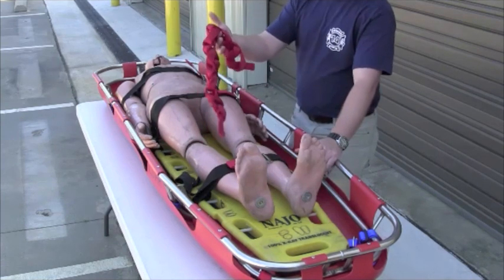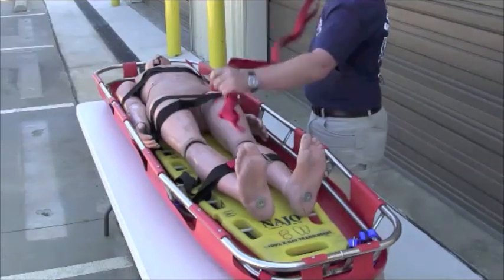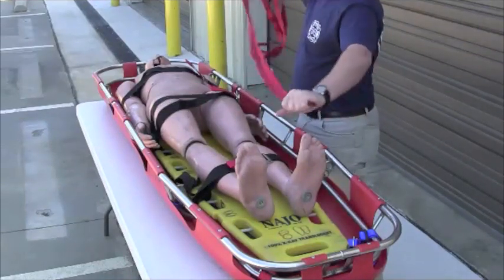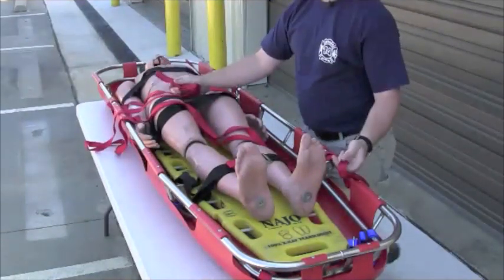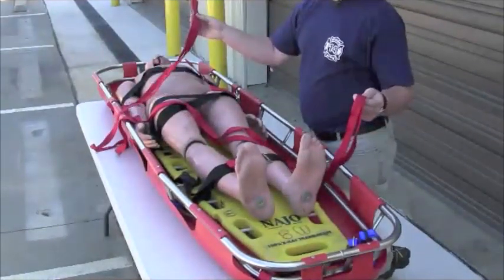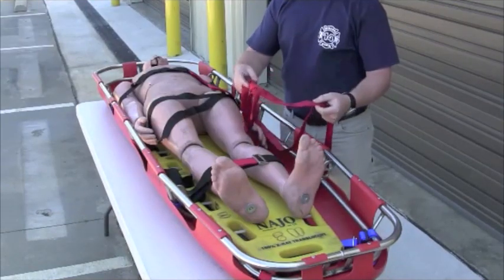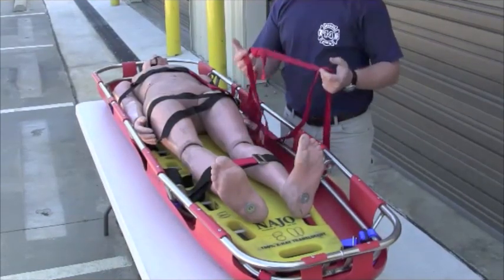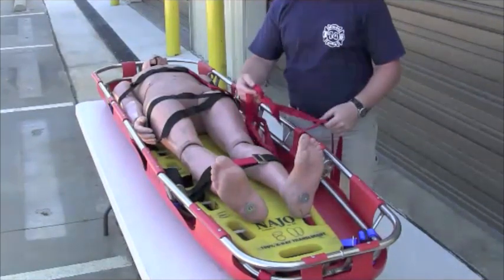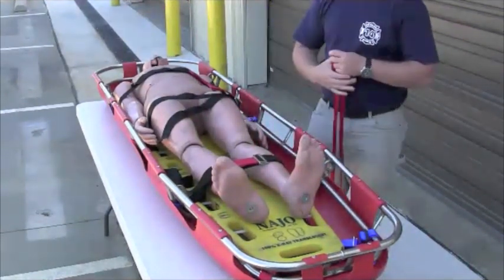Typically, what we're going to use for a patient harness or victim harness is 20 feet of tubular webbing. We keep our webbing daisy-chained so it's easy to get to. Some of us prefer to leave these tied in a loop and some not — this one's not tied in a loop, so all I'm going to do is tie this into a loop. There are several different ways of tying a victim harness. One of the easiest ways is just to take a bite of webbing and slide it underneath the patient's lower back.